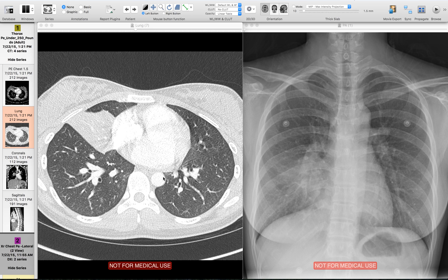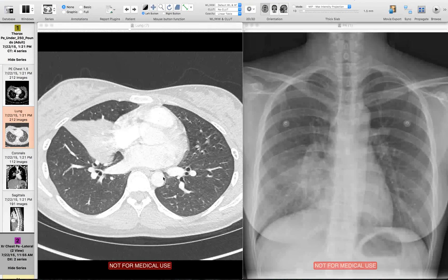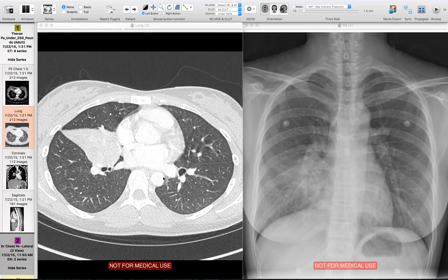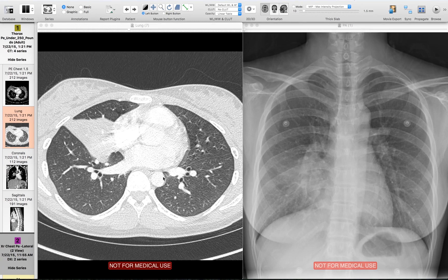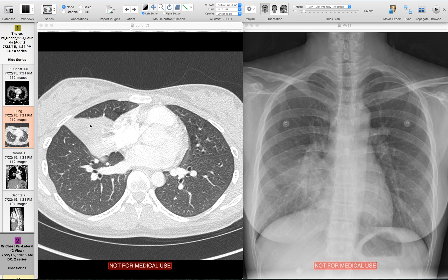We happen to have a CT here. If we look at it, this is the right middle lobe, and there's a consolidation right here which touches the right heart border, confirming our suspicion from the radiograph. We can also see that the right lower lobe is completely clear.